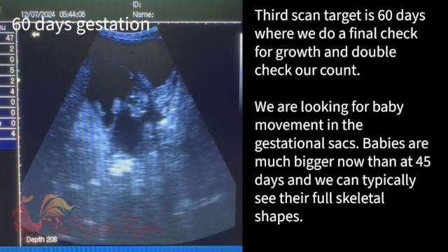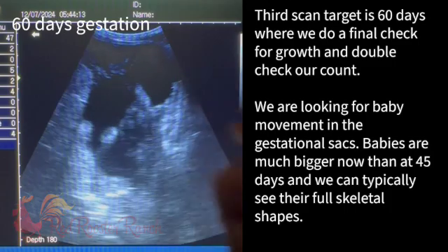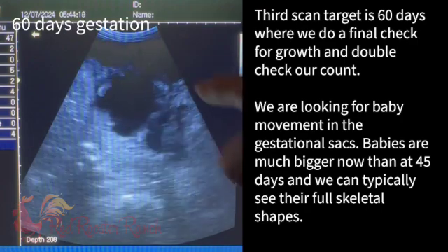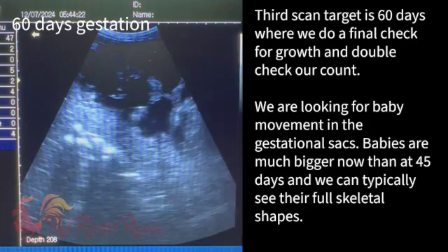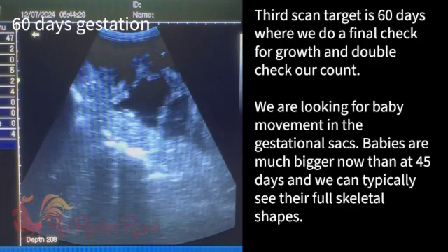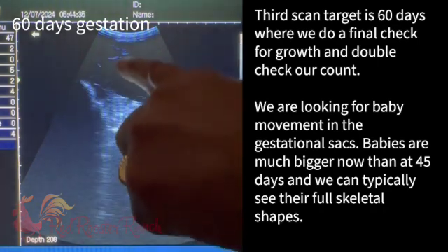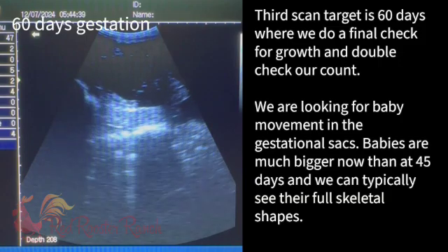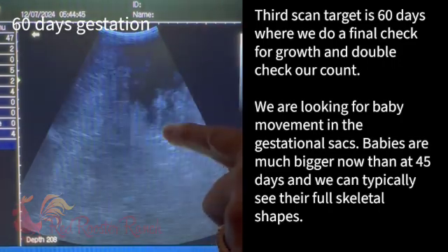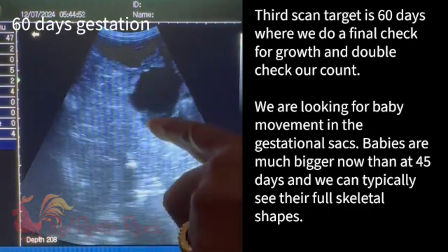We definitely see that baby moving. We've confirmed there's one baby, and there are three to four good-size sacks. One, two, three — there's another baby up there. There we see a really good picture of the skull. You can see the face, the shape of the muzzle, the nose. One, two, three — and there's possibly a fourth right there.